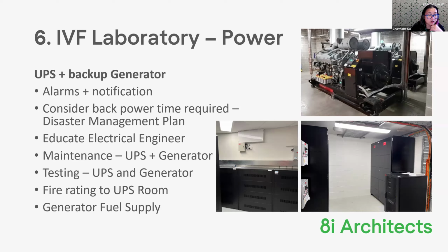Minimum, I would say 4 hours. For the larger facilities, we do 10 to 12 hours. So worst case scenario, something happens overnight, the UPS will keep running until the morning when the scientists come back in. And I have had very, very big labs that wanted almost 24-hour UPSs. So the UPS ends up being massive.